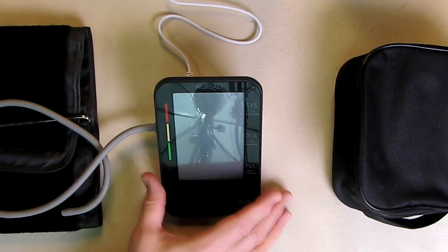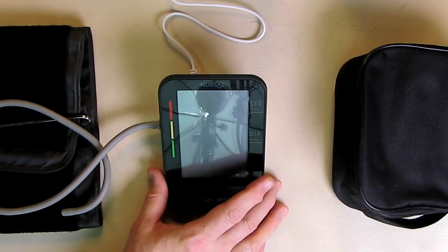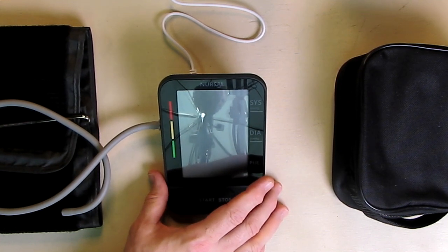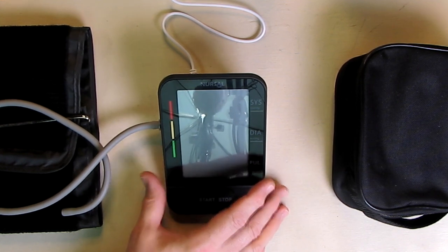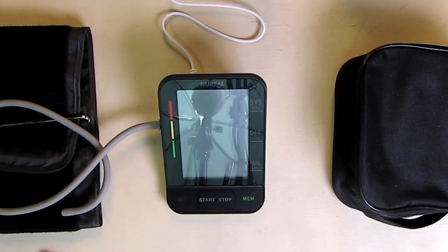You just relax as much as possible. You want to sit for about five minutes before you take your measurement. It's just a good thing to do to relax you. You want to avoid measurements early in the morning because that's when your body has the highest blood pressure.